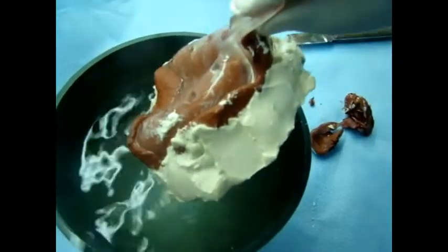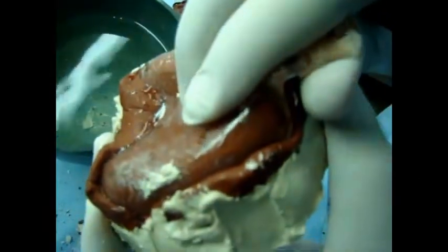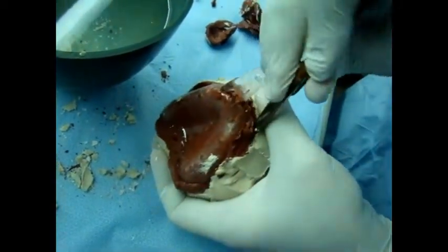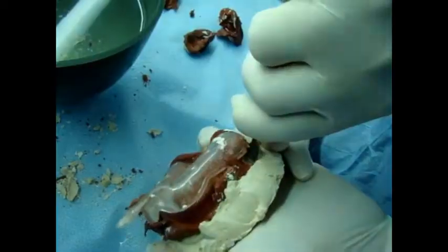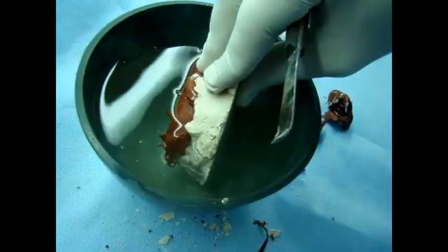Now retrieving the upper impression. There's still some plaster of Paris covering the side of the tray so it's a bit difficult to remove. The tray is removed and then the impression material is removed from the cast.